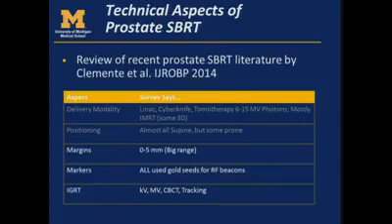And things were all over the place. So delivery modality, what sites are doing, it's a combination of Linac, CyberKnife, tomotherapy, 6 to 15 MV photons only. There were no proton studies here. And most sites were doing IMRT. I think there was 1 or 2 using 3D planning. And I think that is pretty typical when we consider most sites, I think, are also using IMRT or VMAT for conventional prostate radiation therapy as well.